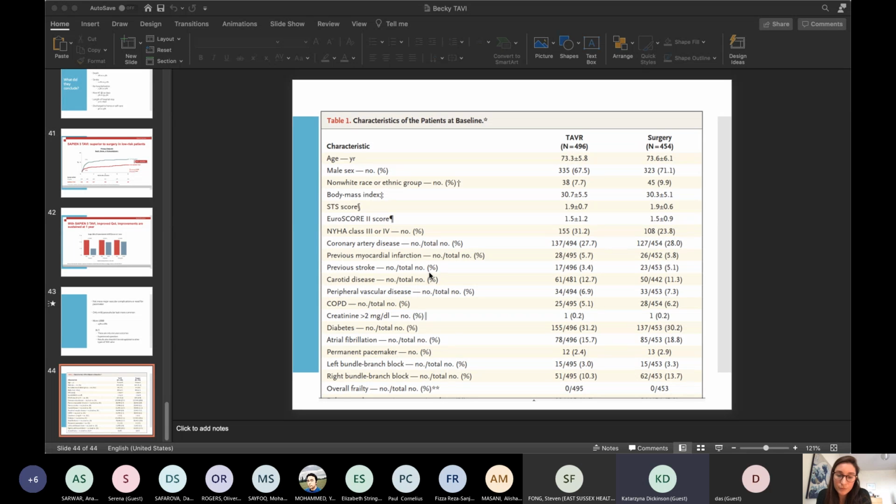So if you put another valve with a ring in it, you sort of shrink the orifice further and further. So you need to look at the size of the original valve and the proportion to the cardiac size and the patient. You can't just be putting valve in valve in valve because they don't stretch beyond what the ring size is. So in some patients, there might be limitations just because of some valve to patient size mismatch in the original procedure.